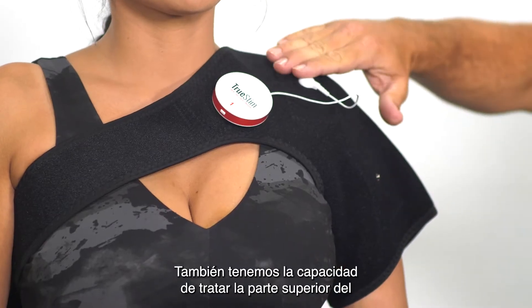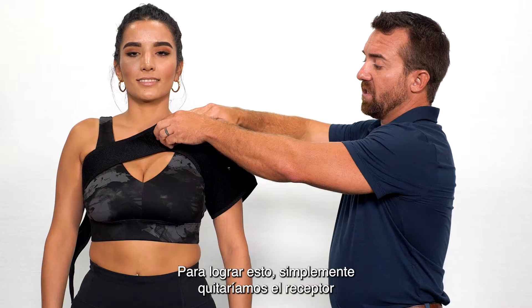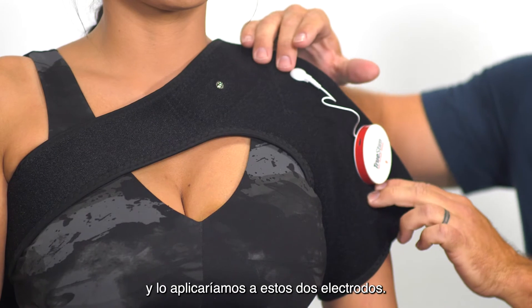We also have the ability to treat the top of the shoulder and further down on the arm. To accomplish this, we would simply remove the receiver and apply to these two electrodes.